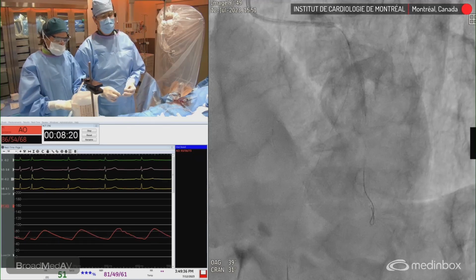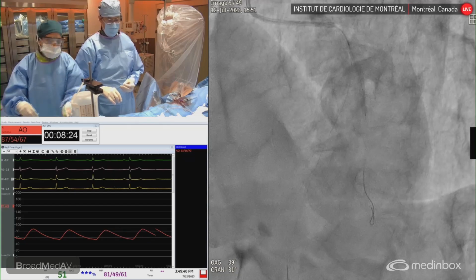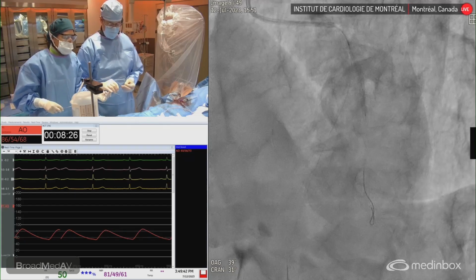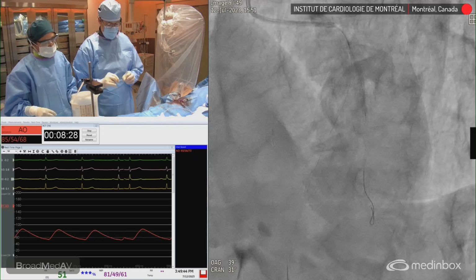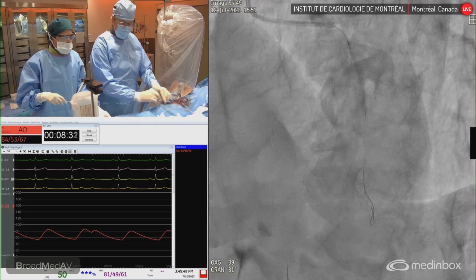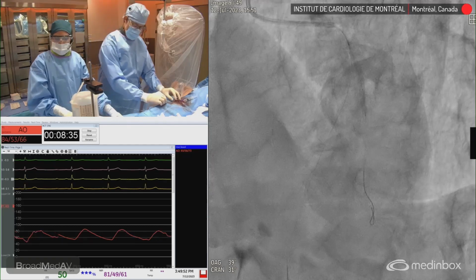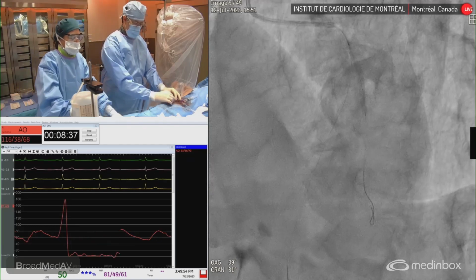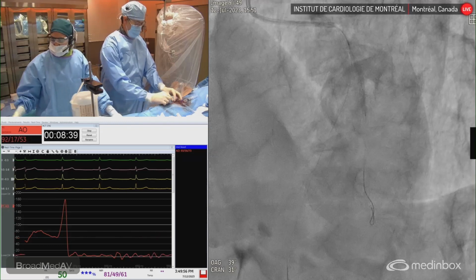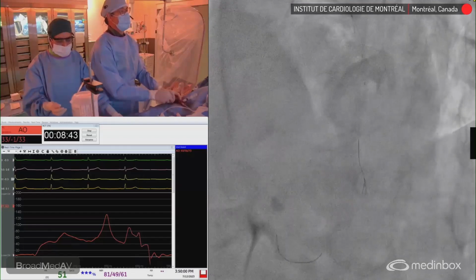The balloon left inside the stent will help us to try to maneuver around the strut of the diagonal branch that may be sticking out, or hopefully sticking out a little bit in the LAD. But we're going to leave this in a neutral position, and then we're going to go in with the non-compliant balloon in the LAD and see how it behaves. We'll just need another inflate.